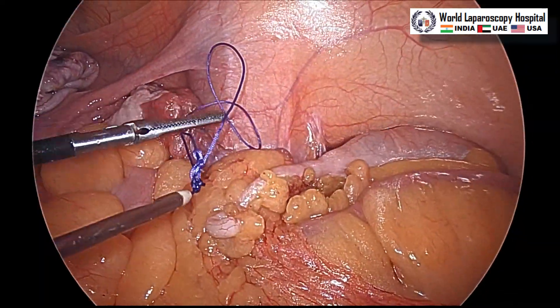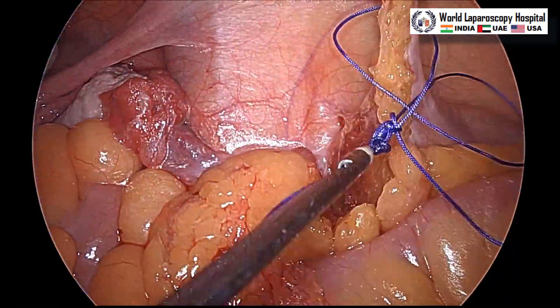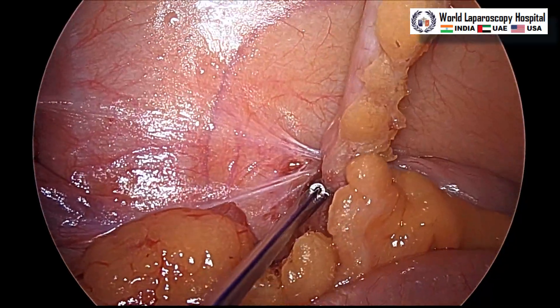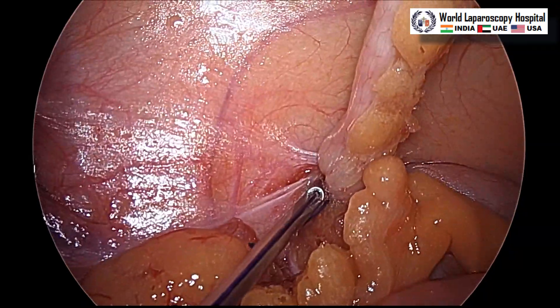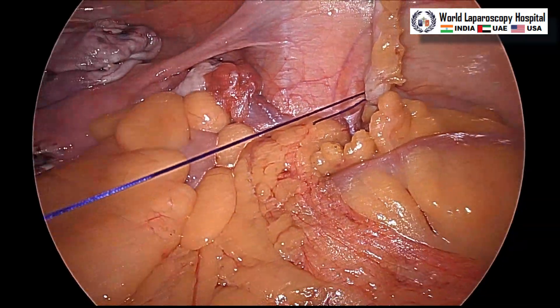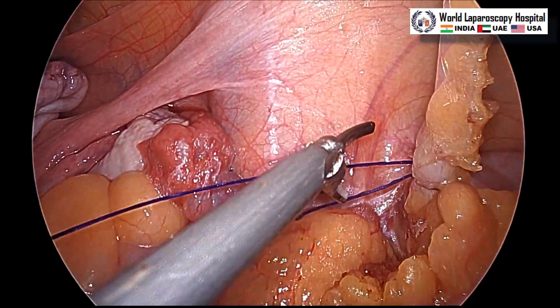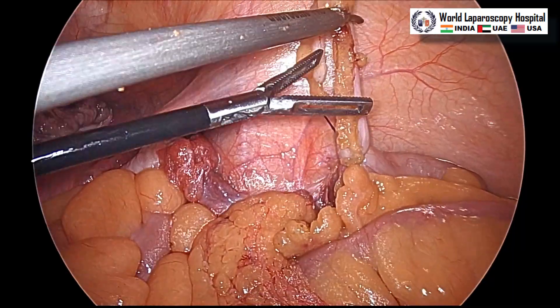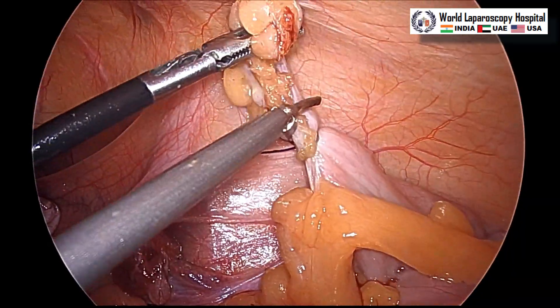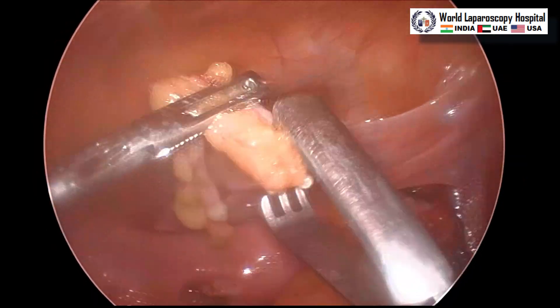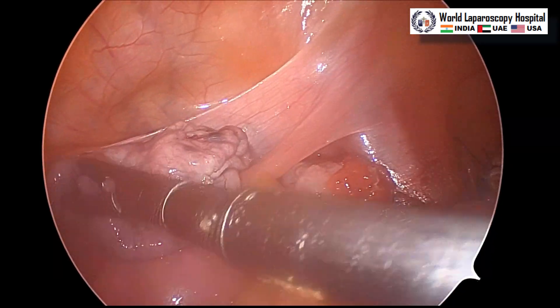Now this is the Meltzer's knot: the grasper is introduced into the loop of the Meltzer's knot, and after that you go to the base and tighten it. This knot — one hitch, one wind, one lock; second wind, second lock; third wind, third lock — is a very strong knot used to tie the appendix with confidence. One knot is more than sufficient. Knotting is always preferred; clipping should be avoided, but if you want to clip you can use DS clips — double strand clips available for appendectomy — or you may use a stapler. Leave three to five millimeters in front of the knot and the appendix is cut.